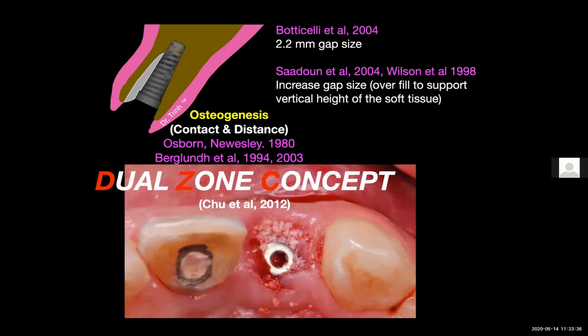Regarding bone regeneration, there are two biological processes that happen. In the simplest terms, you have the resorption of the graft material as osteogenic cells migrate to the site to deposit new bone onto the implant surface and the surrounding bone walls. Now, assume that you reach above 30 Newton centimeters, which is the threshold for primary stability, and you have an intact buccal wall that is 2 millimeters thick. After you place your graft material inside the gap, you proceed with placing either a healing abutment or an immediate provisional without having to place a resorbable collagen membrane barrier.